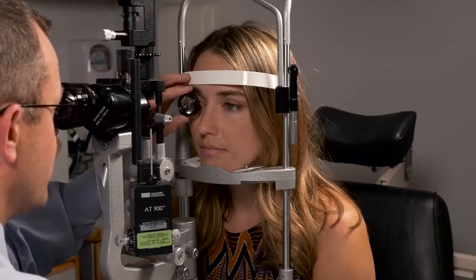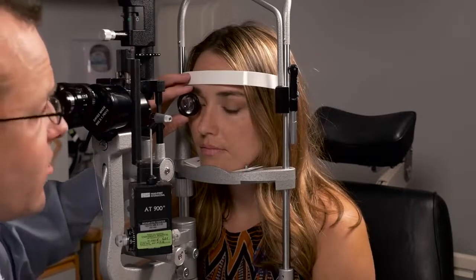First thing you do when you look in the back of the eye is to look at the nerve of the eye. You'll look at the size, you'll look at the optic cup, and you'll look at the borders of the nerve, and you'll look at the blood vessels coming out of the nerve.